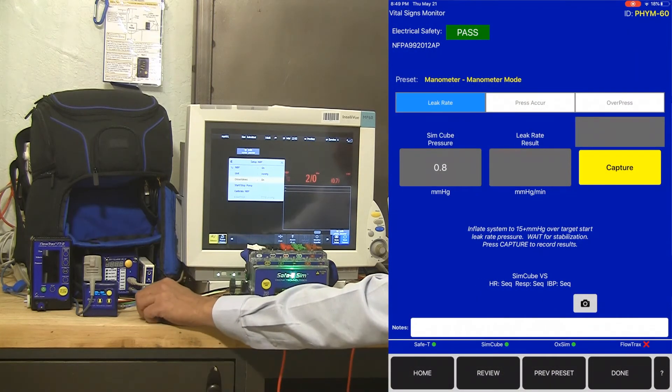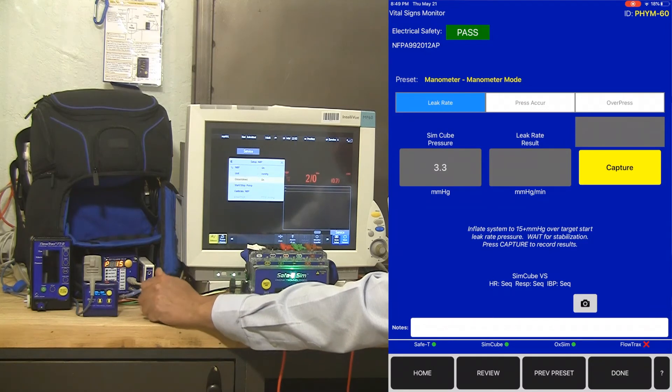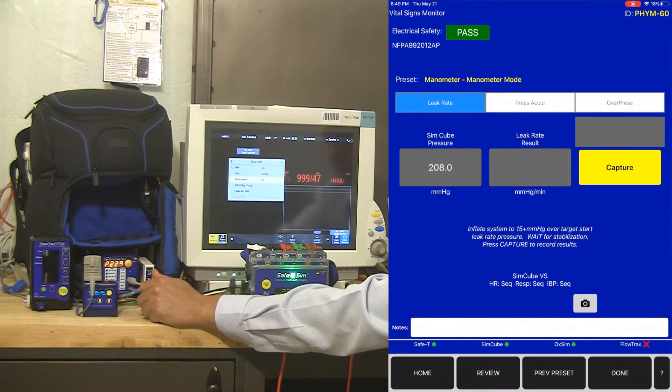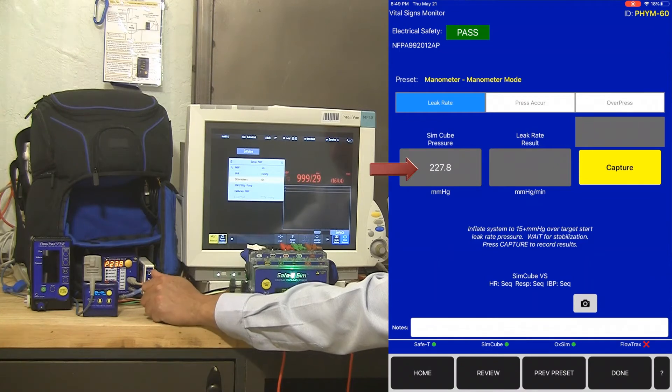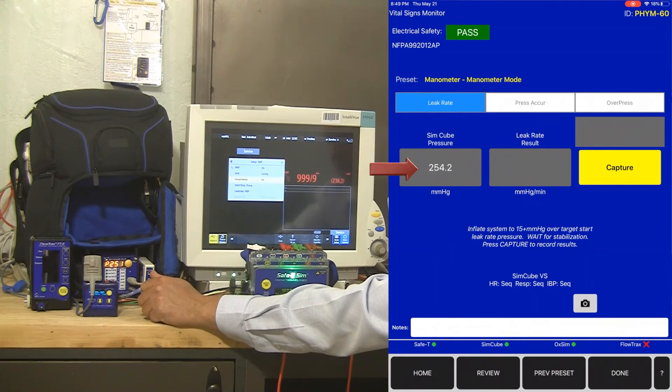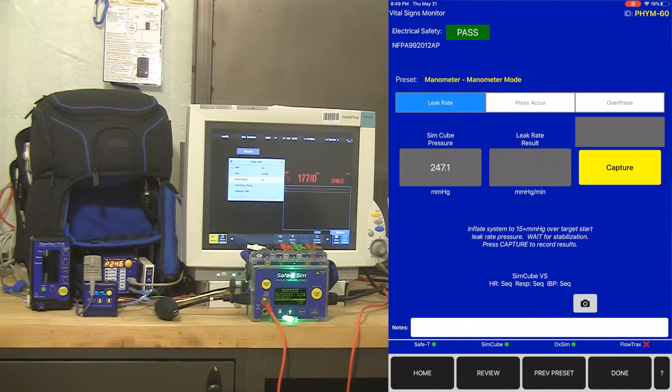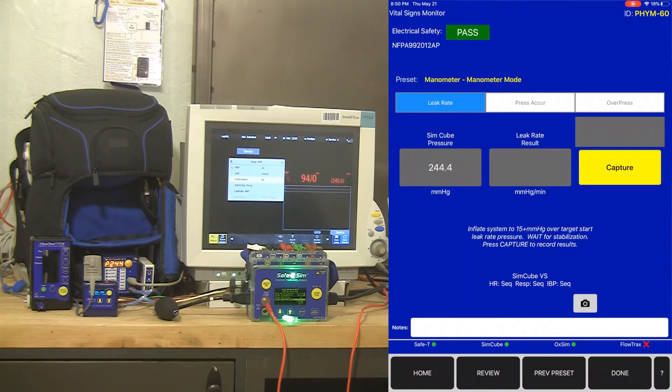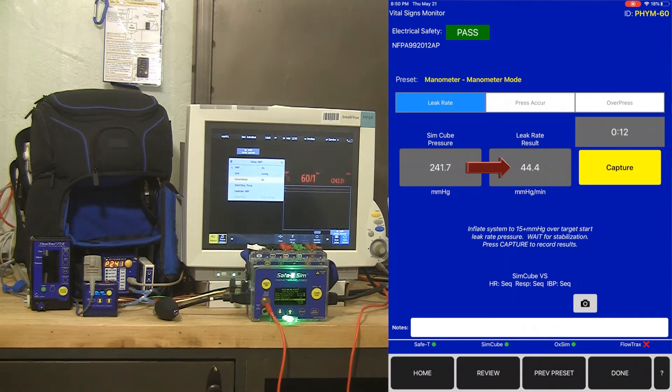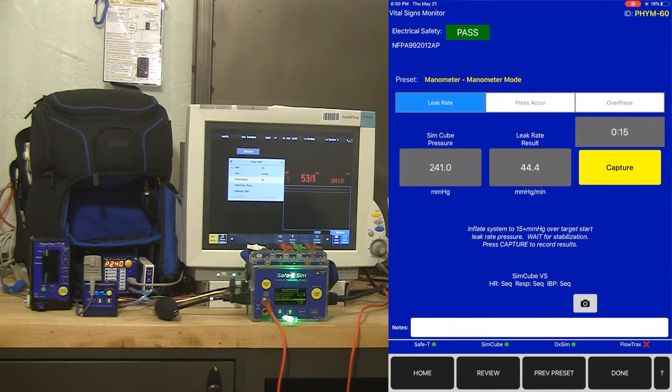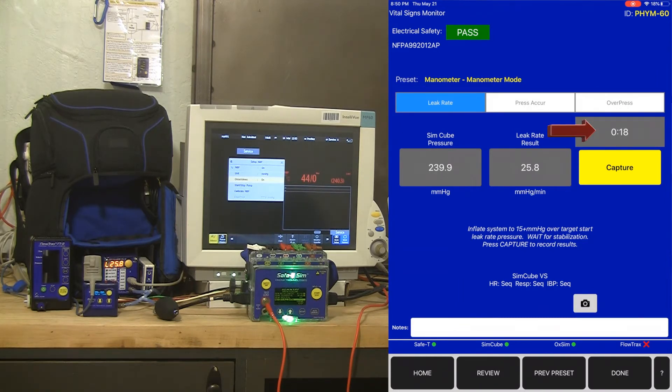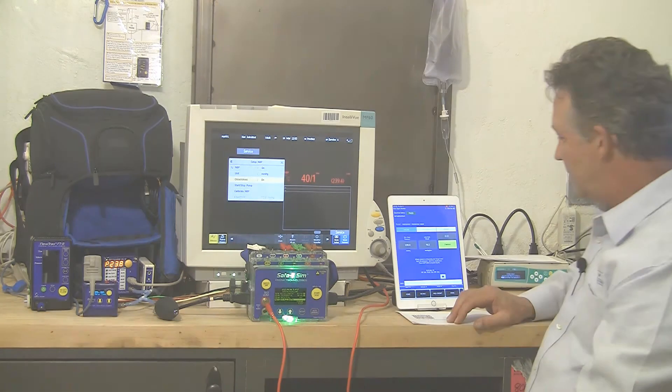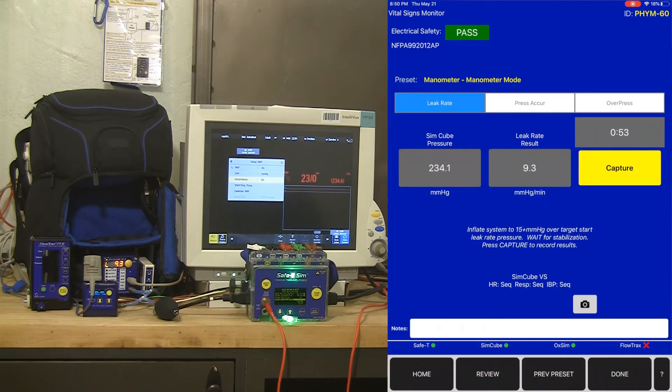So I'm going to inflate the system to about 240 and I can see on my app that it is tracking the pressure of the SimCube. Here's about 240 and so I can see my real-time SimCube pressure right on my iOS device and it's going to start calculating a leak rate. So we've got now a leak rate result in this box. We've got the SimCube pressure in that box and we've got a timer that lets us see where the time elapsed is in the leak rate testing. So we're at about 53 seconds now.